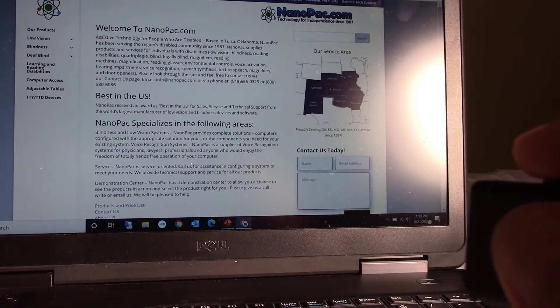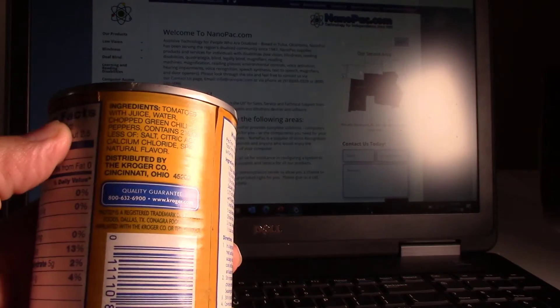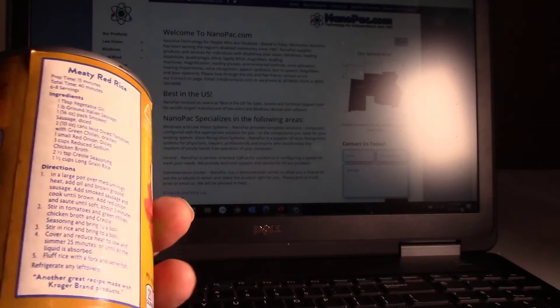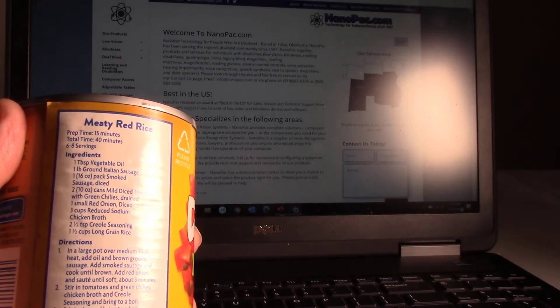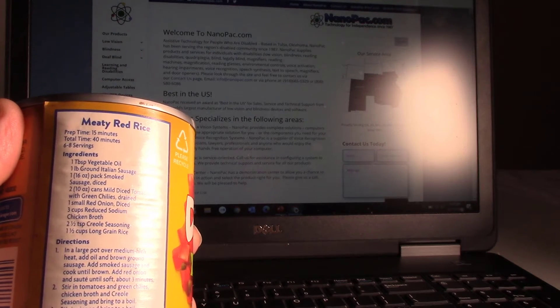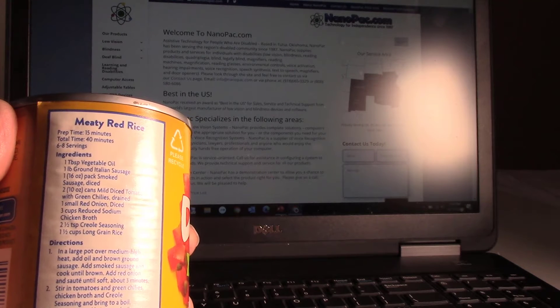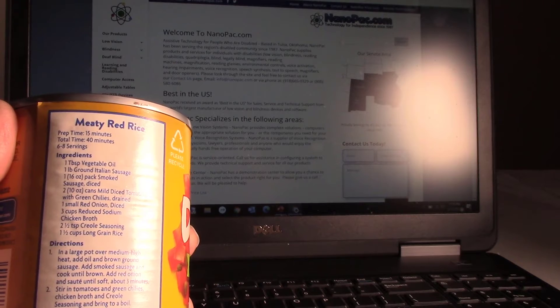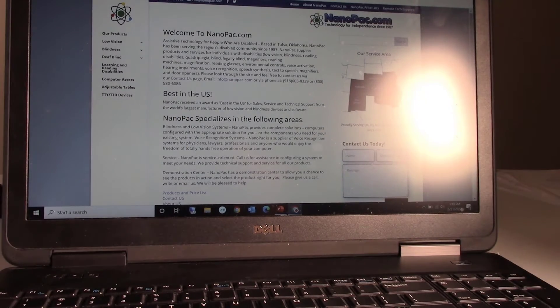That is so cool. You can even take something like a soup can — this is pretty small print — but let's see if we can get something out of this. The device reads: 'Prep time: fifteen minutes. Total time: forty minutes. Six to eight servings. Ingredients: one tablespoon vegetable oil, one pound ground Italian sausage, one six...' I promise you cannot do that so quickly with any type of smart device.